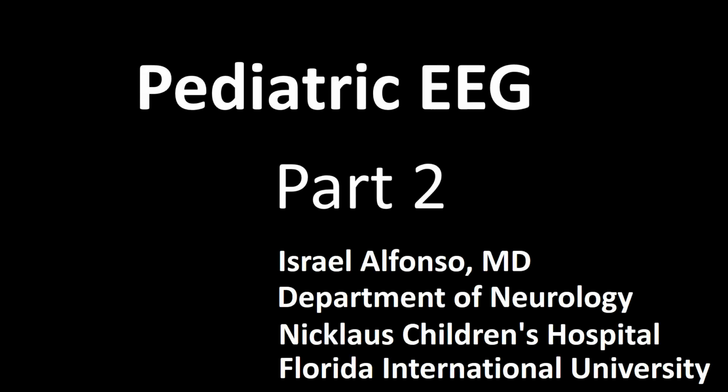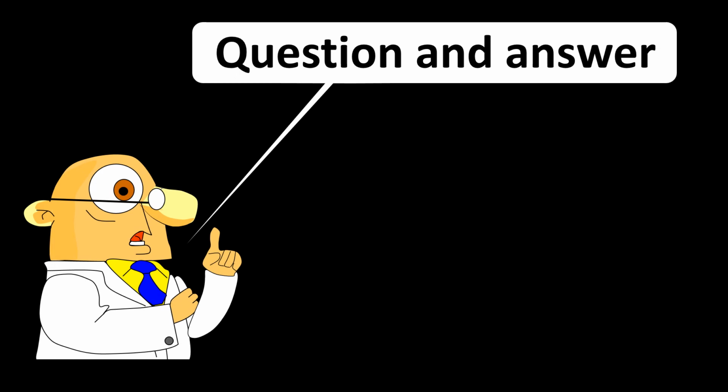This lecture is the second in a four-part series about pediatric EEGs. It will be conducted in a question and answer format.